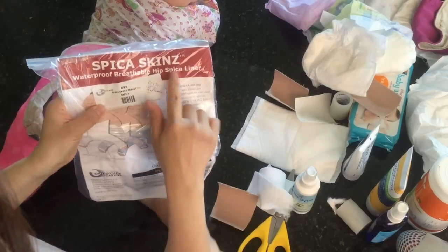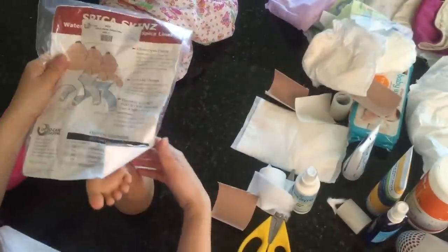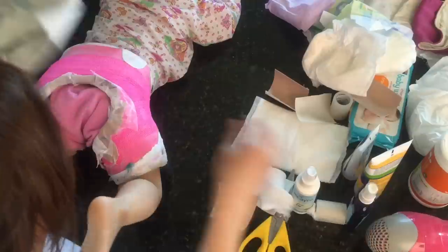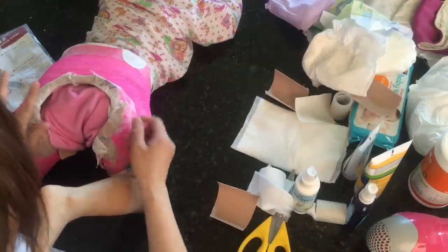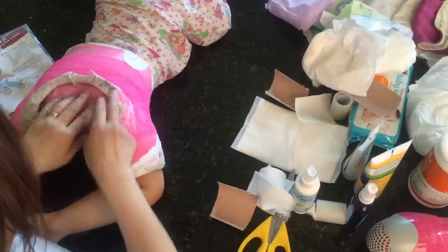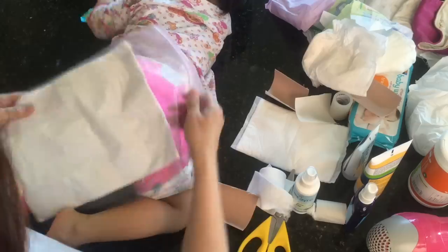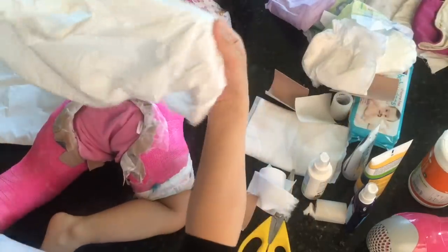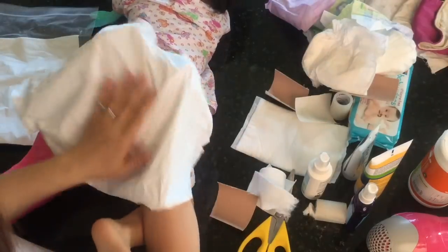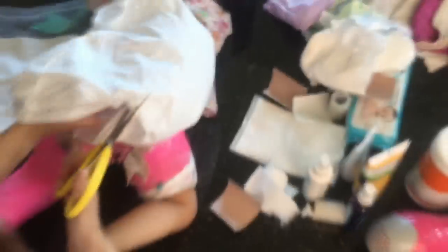The hospital gave me something called the 'spica skin waterproof breathable hip spica liner.' I don't think they give it at discharge, but when I went back the second time I asked for it because the gore-tex was leaking. Once it starts leaking it smears into the whole spica cast and starts stinking really bad. This liner comes in pieces — it's the exact stuff they use to line the spica cast.